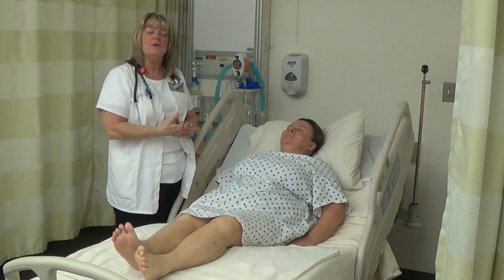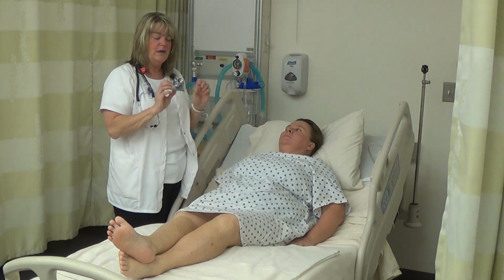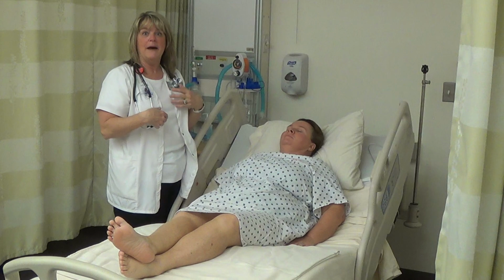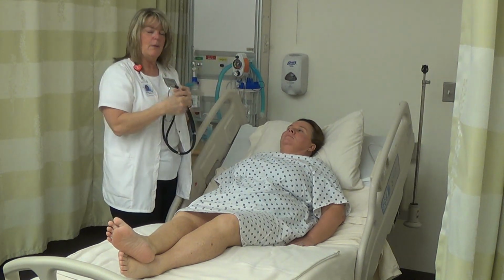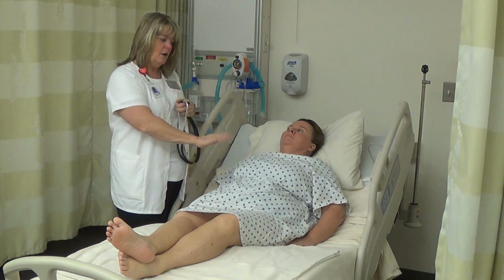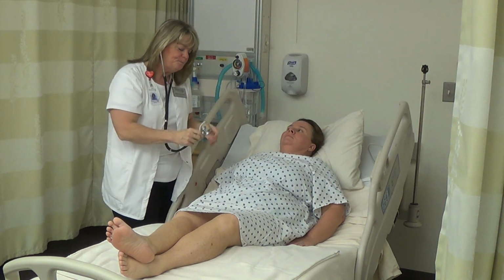All right, so now with the belly. We do not palpate first with the belly. We auscultate first. If you palpate first, you will stimulate peristalsis and you will alter what their normal bowel sound pattern is. So the first thing we're going to do is listen to her belly. Now again, you want to get underneath the gown, underneath their clothes, and be skin to stethoscope contact. But for the sake of this video, we're just going to do it on top of the gown.